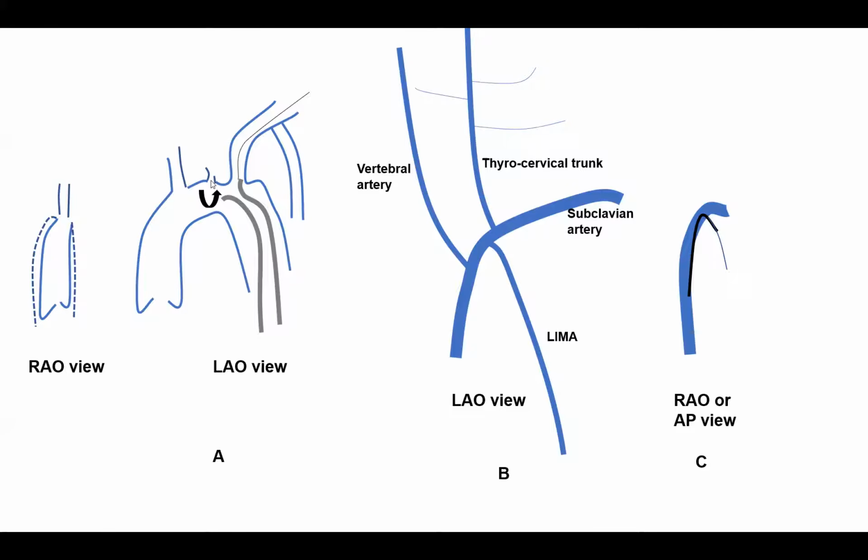If you keep falling into the carotid, one of the easiest ways to do it is to just pull it back and it will fall straight into the left subclavian. There is a hazard in just pulling it back. There is a tiny risk of embolization. I don't think it's a high risk, so I think it's reasonable to do if you keep failing in the first maneuver. Okay?